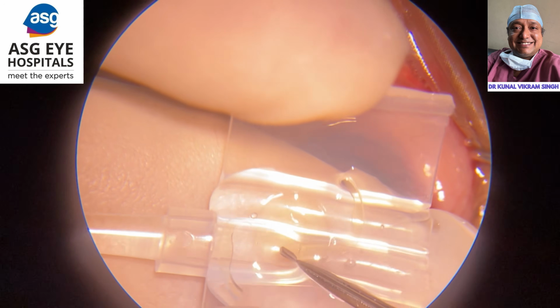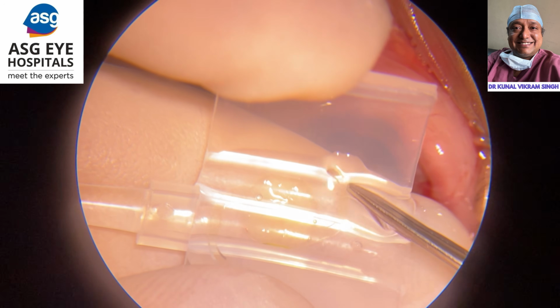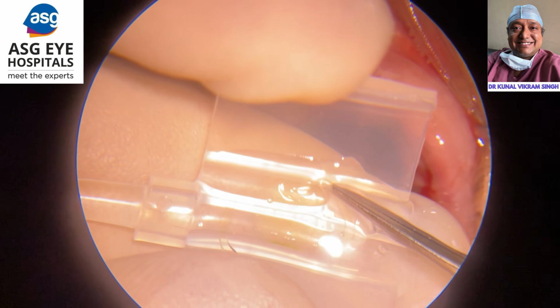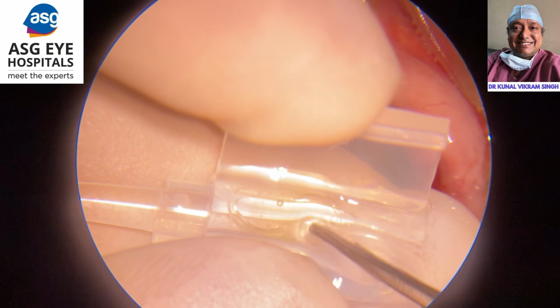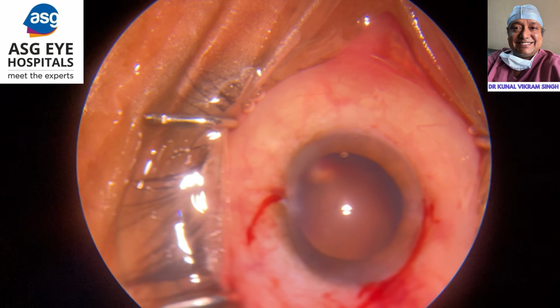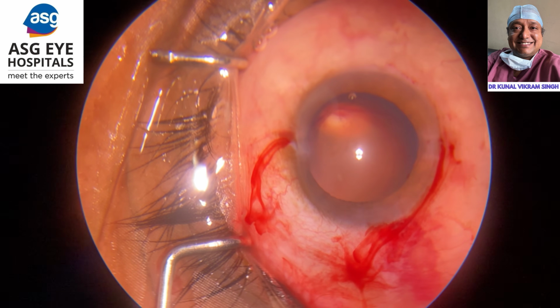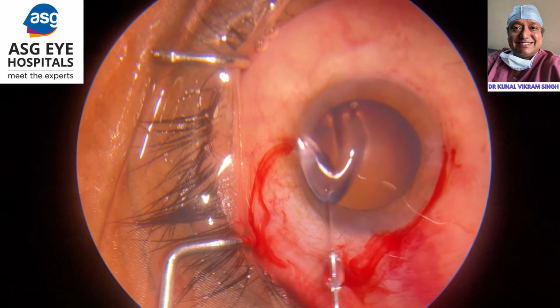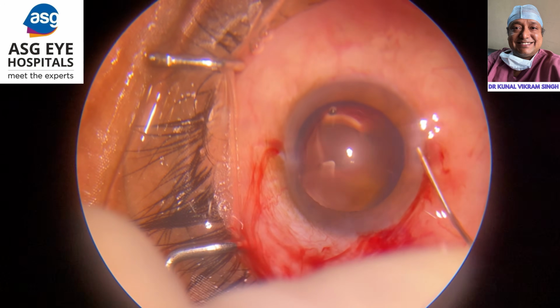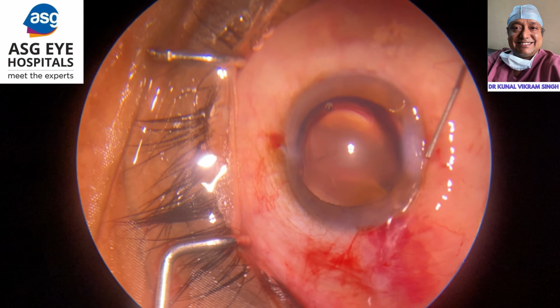constrict the pupil using pilo. And in case later, post-operatively, I find that the AC is not formed, I would give some mannitol and manage it that way. In such cases, because the AC is already bad, I did not want any mal-loaded IOL, so I do the loading myself. Otherwise, I let my assistant do it.